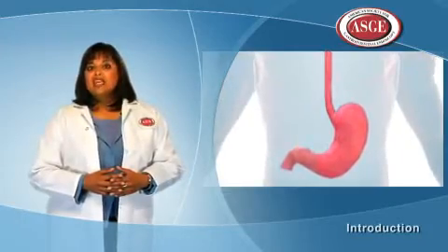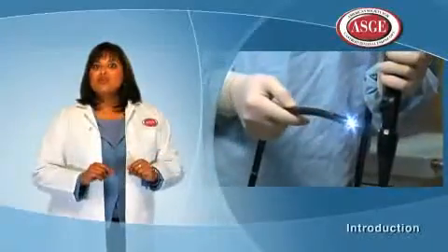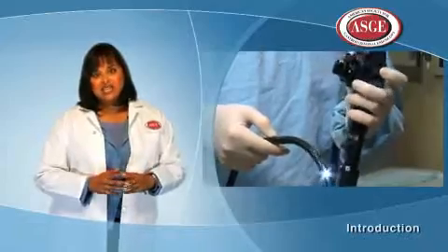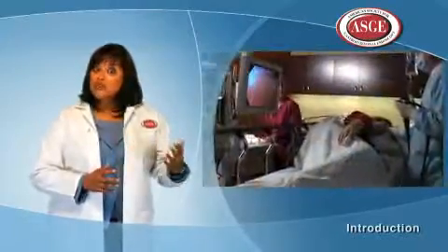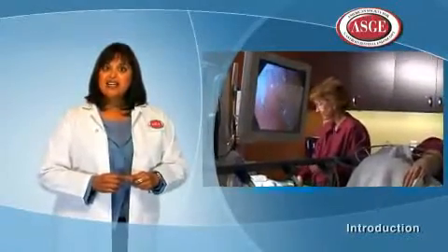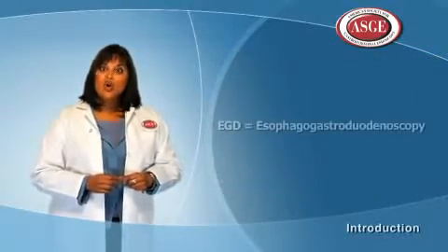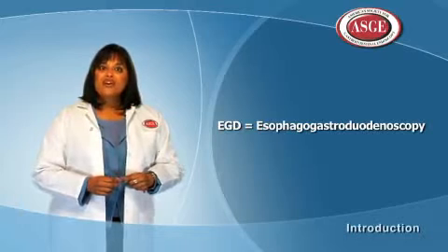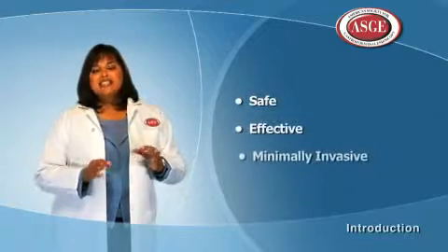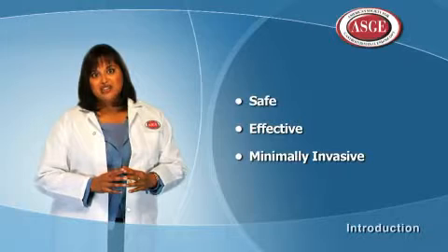During an upper endoscopy, the doctor uses an endoscope. An endoscope is a thin, flexible tube with a small camera and a light on the end that allows the doctor to see inside the gastrointestinal tract. Pictures are transferred from the endoscope to a TV screen that your doctor watches to find abnormalities. This procedure is referred to as upper GI endoscopy, or EGD, which stands for esophagogastroduodenoscopy. Upper endoscopy provides a safe, effective, minimally invasive way to see inside the upper GI tract.